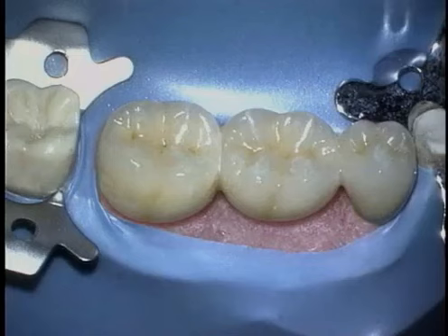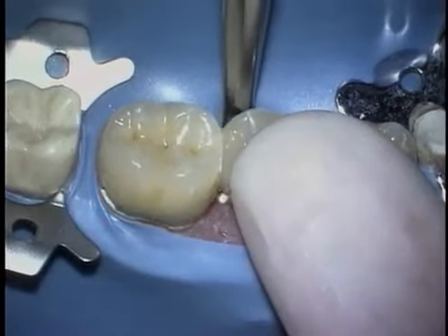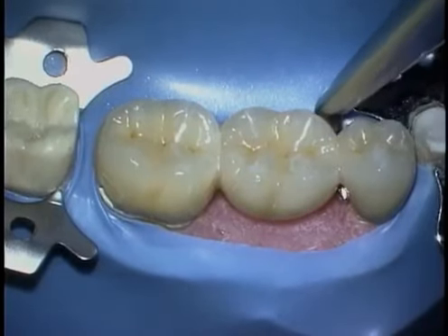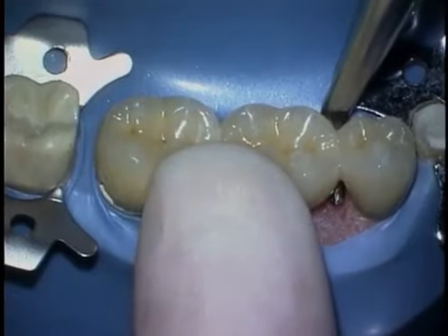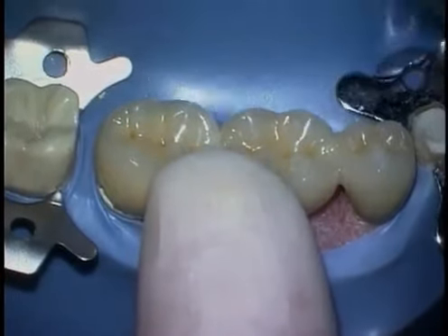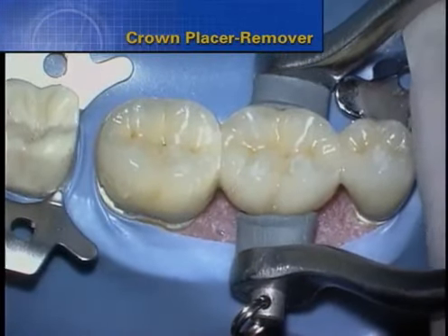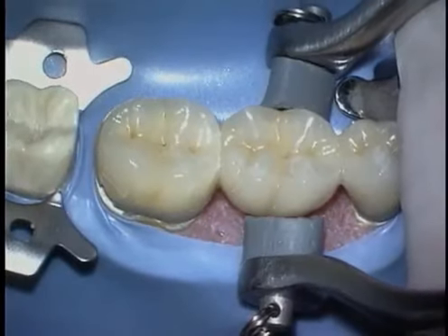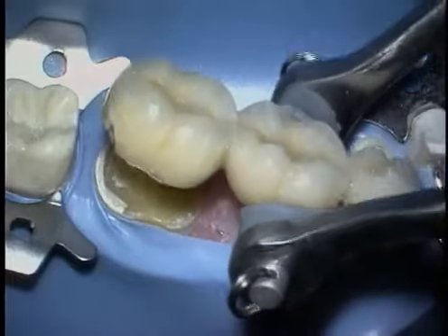In the clinical situation, the appropriate tip is placed just mesial to the posterior abutment. The finger is applied for safety. It is important to apply steady pressure with the device on the engaged restorative while activating the trigger. Now that the bridge is loosened, the crown placer remover with rotating grippers is selected to cushion and protect the bridge. The grippers are best positioned below the buccal and lingual heights of contour to facilitate retention during the removal process.